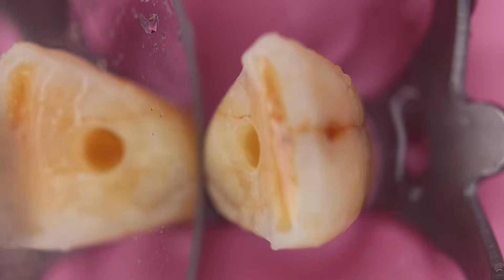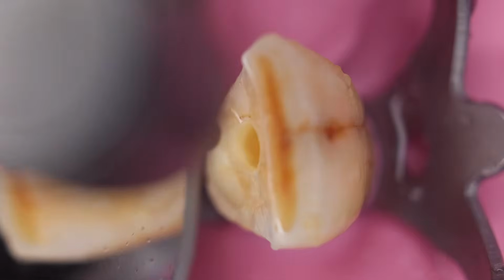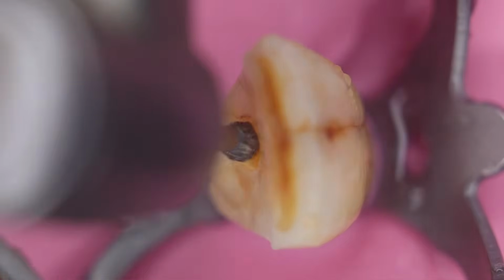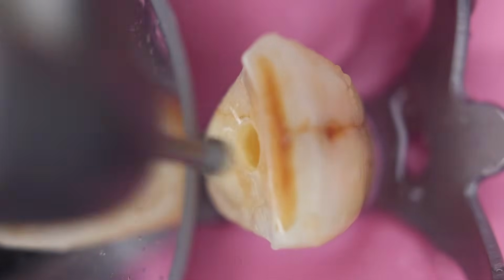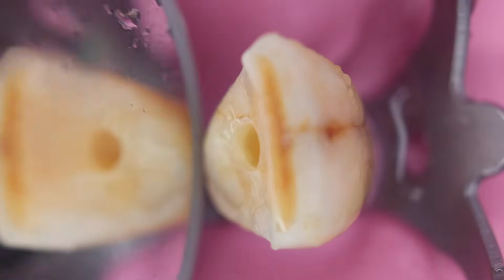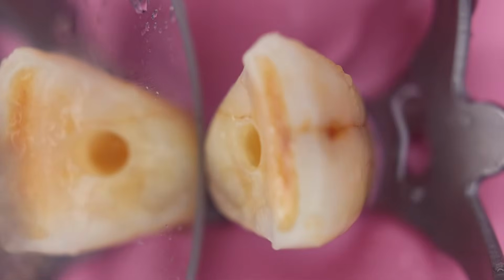So now is the time to angulate this round burr into the long axis of the tooth. Now you can angulate this burr, and then we will shape the access cavity once we get the burr drop. So hope now you can evaluate it.